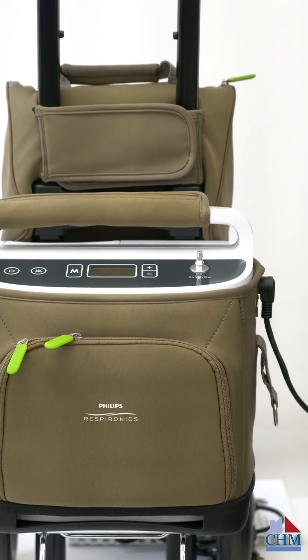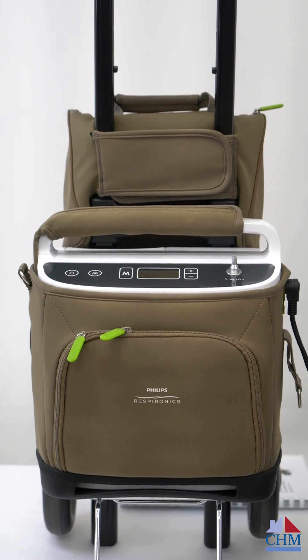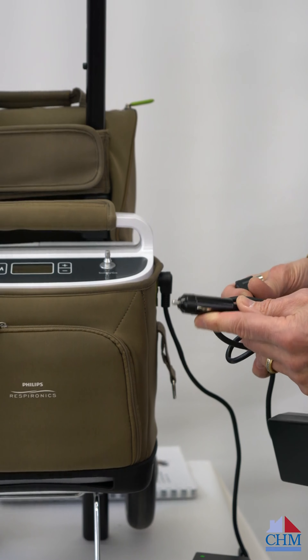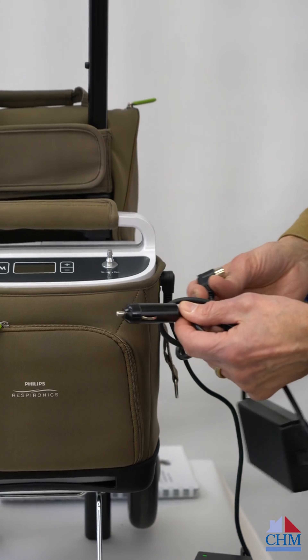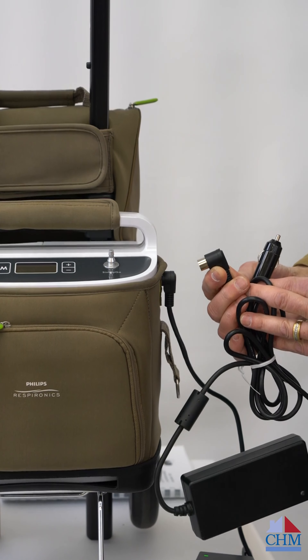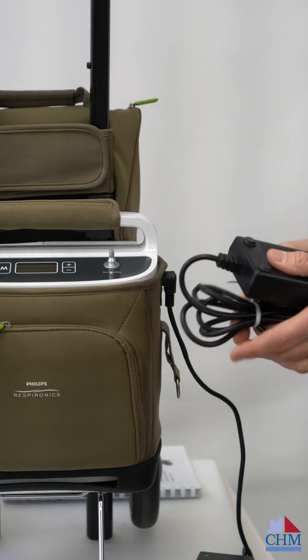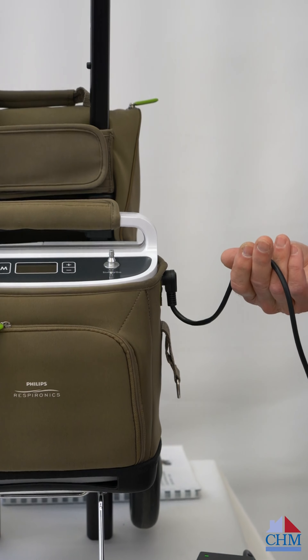The other option for power is a car adapter. This plugs into an automobile 12-volt outlet so we can get car power that way, and it plugs into the side of the unit in place of the AC charger. With the car charger in place, we've got unlimited use as long as the car is on and running. The same applies as long as it's plugged into the wall.